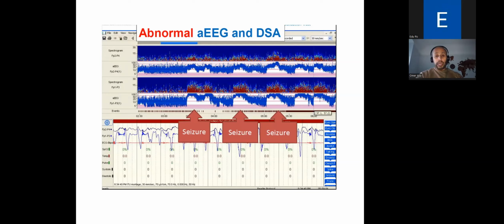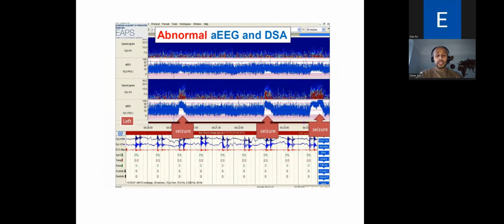Just by looking at this broadly, you can see that this patient has been having, if the top strip represents 4 hours, over a period of 4 hours, 1, 2, 3, 4, 5, 6, 7 seizures, each of which lasted a significant period of time. So then the question is, is that significant in this particular patient? Do you want to treat it by escalating your anti-seizure medication? This is again more evidence. I will show you a number of different examples of CFAM and how they might be interpreted.